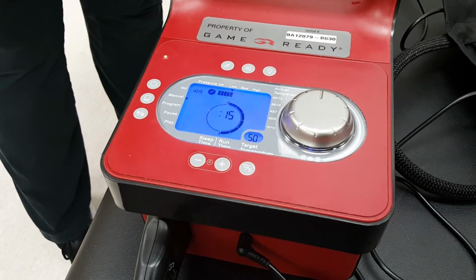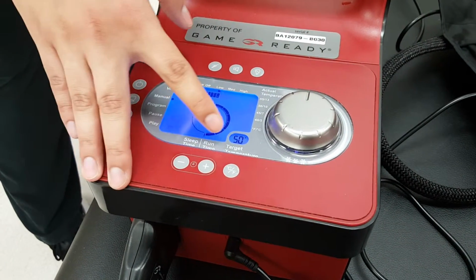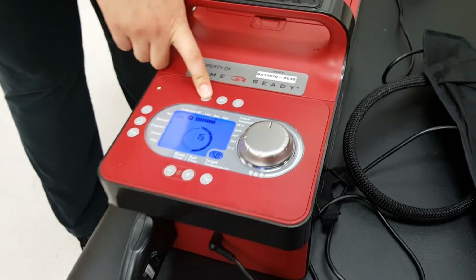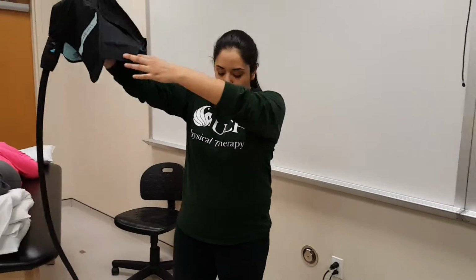The Cameron text recommends that you use 15 minutes of therapy every 2 hours and that you keep the temperature between 50 and 59 degrees, as we have shown here. And today we'll be using medium compression for the ankle sprain. And then next I'll show you how to put on the ankle cuff on my patient.